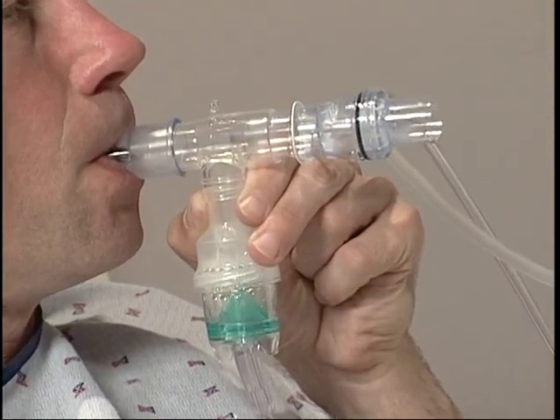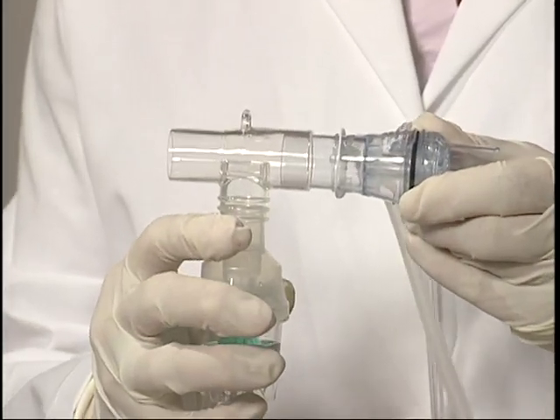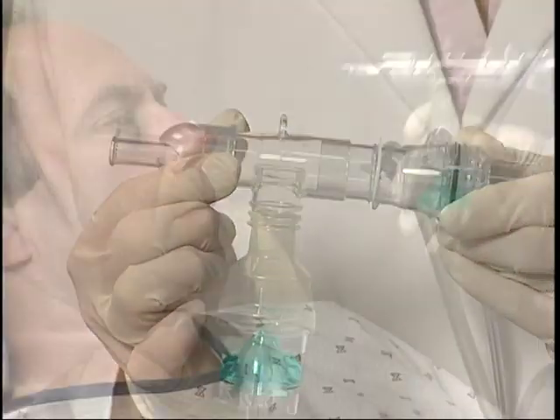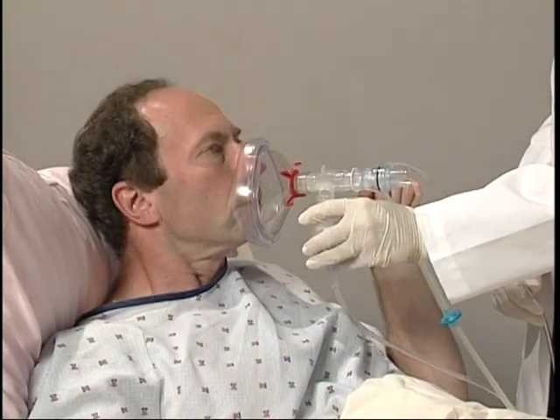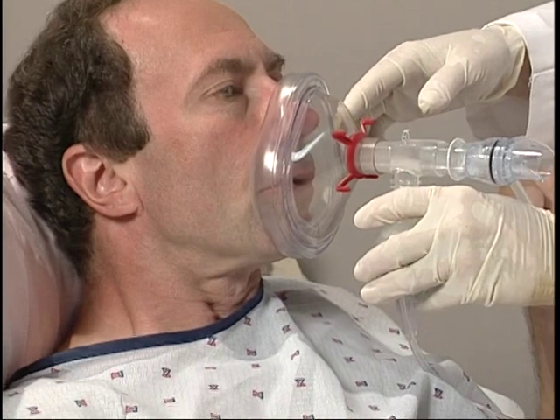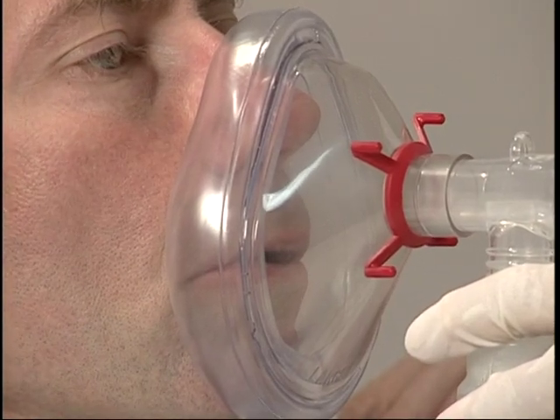Follow the setup instructions for each device and verify that all connections are secure. Setup is straightforward: place the nebulizer between the mouthpiece and the device. Place the mouthpiece lightly into the patient's mouth and be sure that the patient maintains a tight seal on the mouthpiece during therapy. Recommend the use of a nose clip if necessary. If using a mask, apply it tightly but comfortably over the nose and mouth. Instruct the patient to breathe diaphragmatically and perform breathing through the device as recommended.